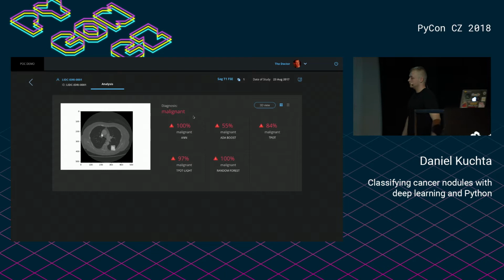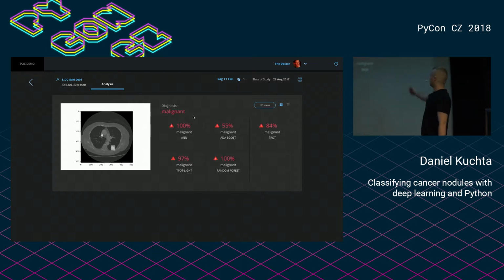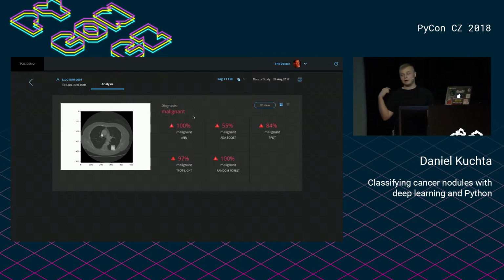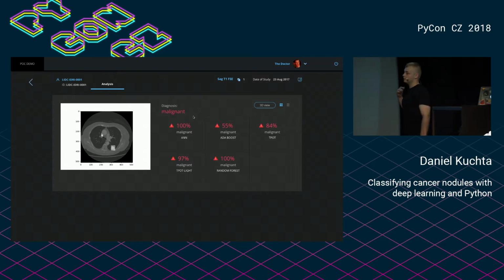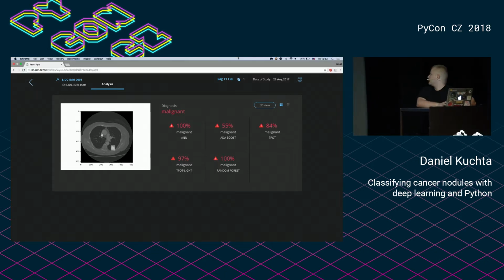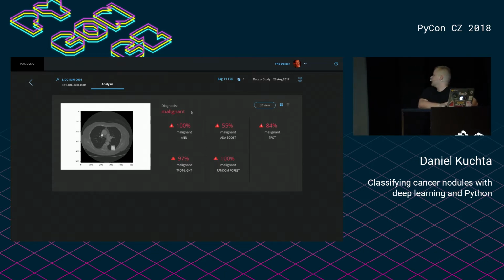set by an actual radiologist. And these are the outputs of our 5 algorithms. The 3D convolutional network is not there, but that's the job of the front-end guys. So you can see the outputs of our algorithms match the actual prediction. That's not the case in 100% of the records, but yeah, it works in general, in 92% in general.